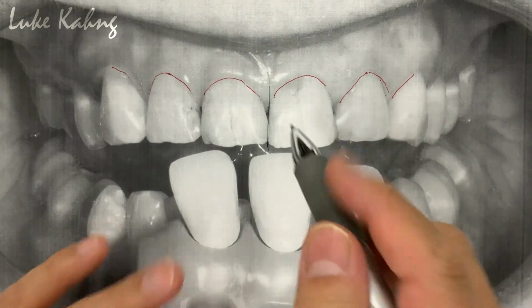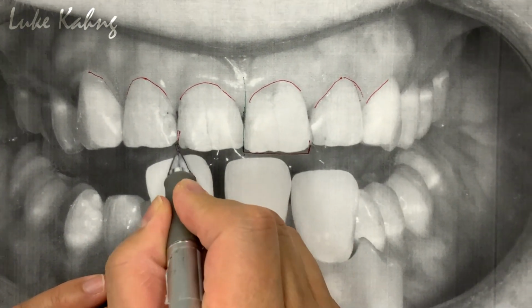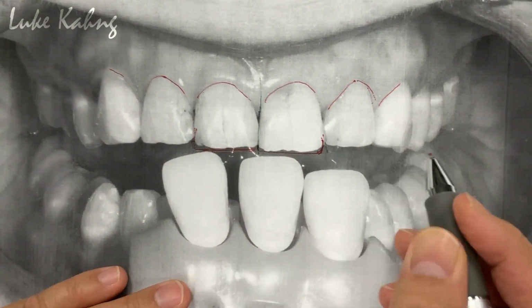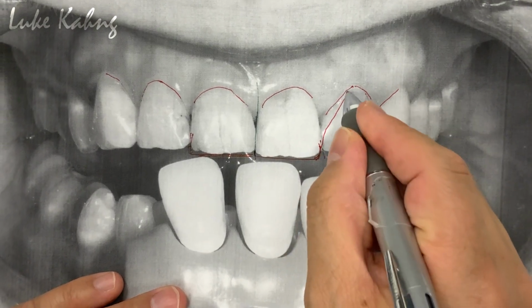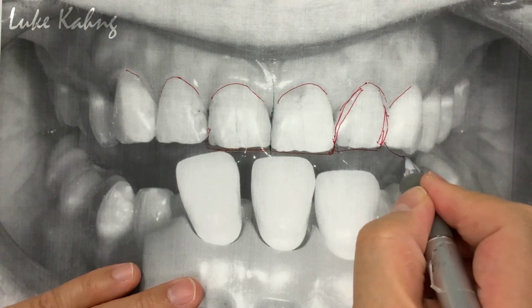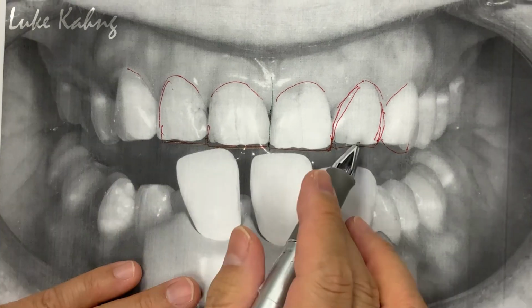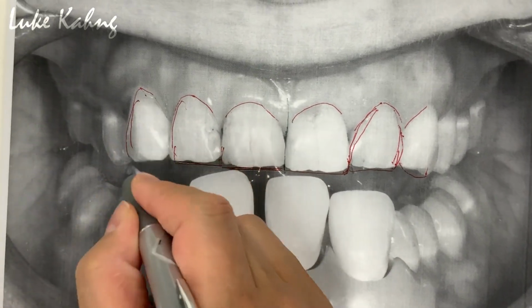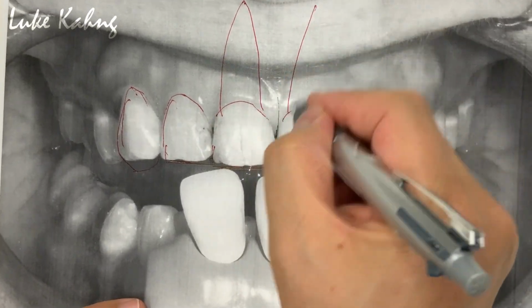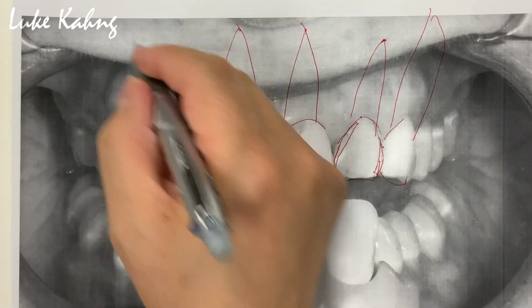And besides that, we have to create a good amount of shape and contour here. It depends on the patient's desires, rounded or square, rounded like that. So we can make this better. The lateral shape here, canine is pretty good. Of course, we can change the color too, a little bit more here. Then we don't have any problem about the root long axis. This is the main key.